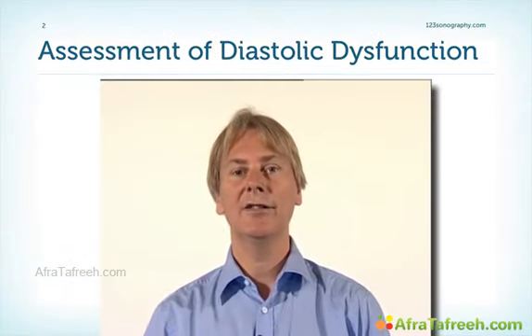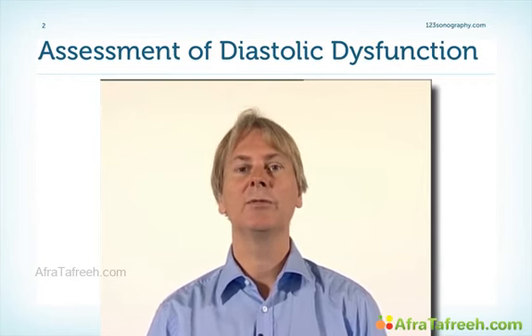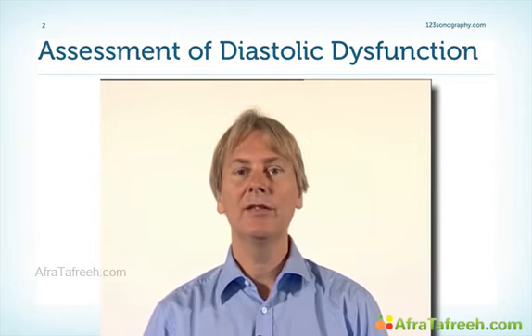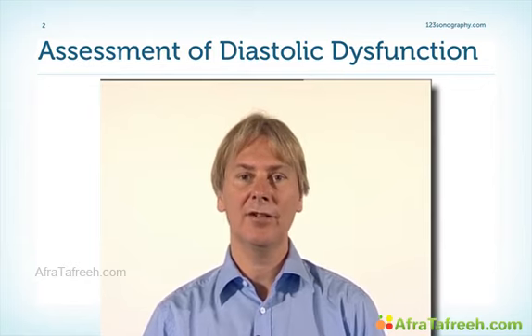We now know what diastolic dysfunction is. We know that it is very important, and we also know which modalities we have to assess diastolic dysfunction. But now we need to go into more detail so that we can actually grade the severity of diastolic dysfunction.